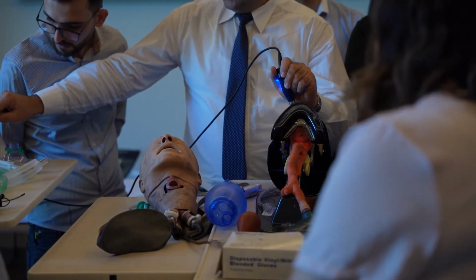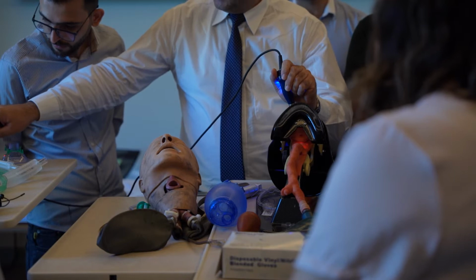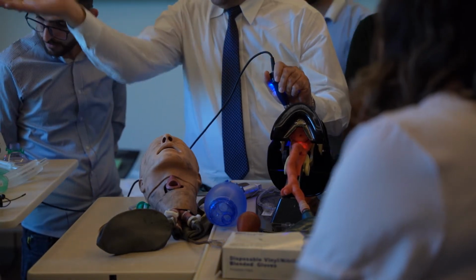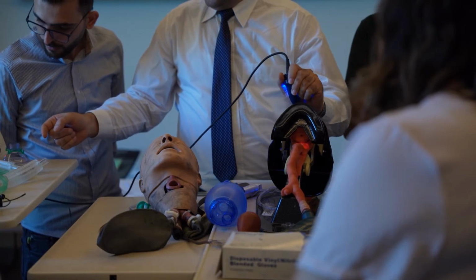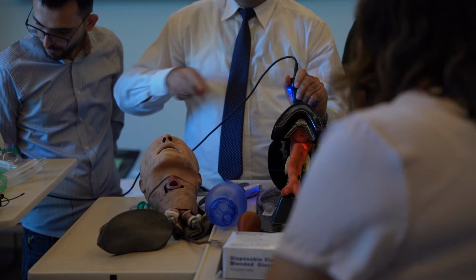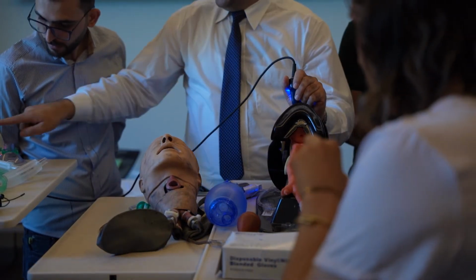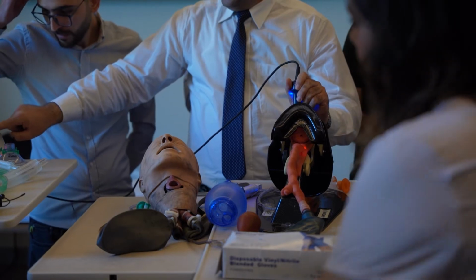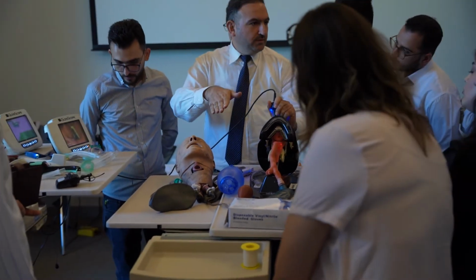We should go to this space between the tongue and the epiglottis. We put the blade here and then move up. Why? In order to see the vocal cord. That's the vocal cord. It's like an 8 in Arabic, okay? If you see the vocal cord, you can put the tube inside.